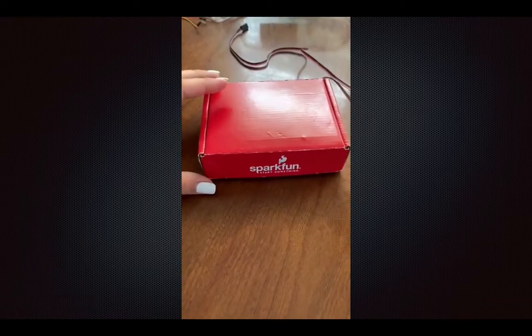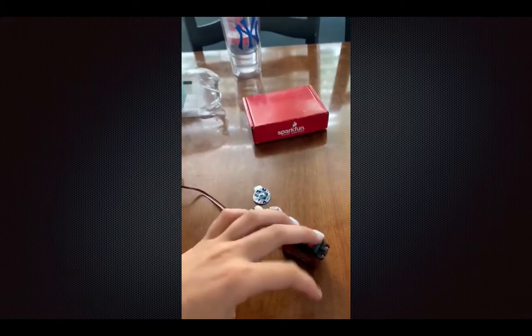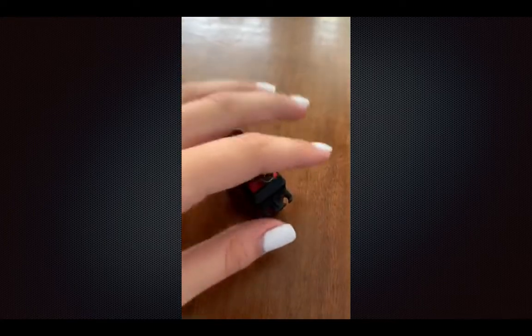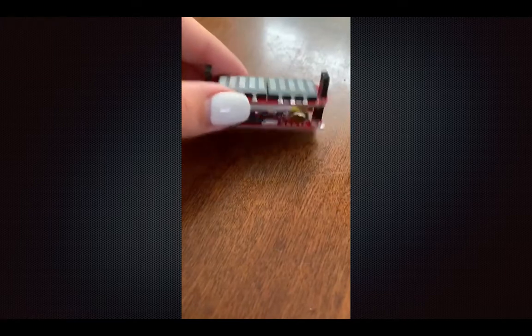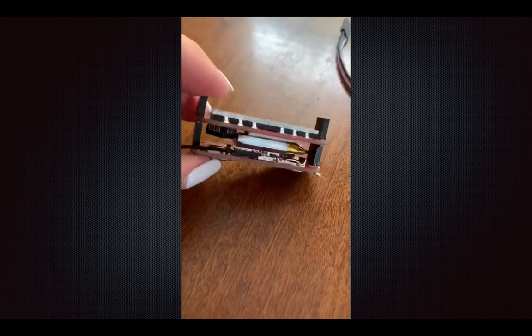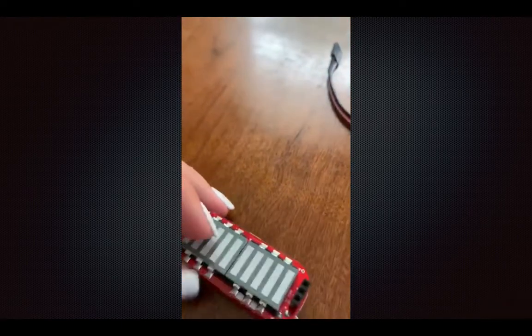So first we are working with these MyoWare muscle sensor development kits. So this one's already a little bit set up, but upon opening it, you get a motor that we already have the screw in, and you put this on top, which will control movements later. And then we have the MyoWare LED shield soldered on to the MyoWare sensor, so that's attached.